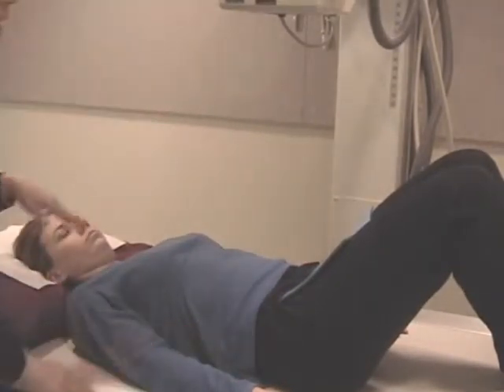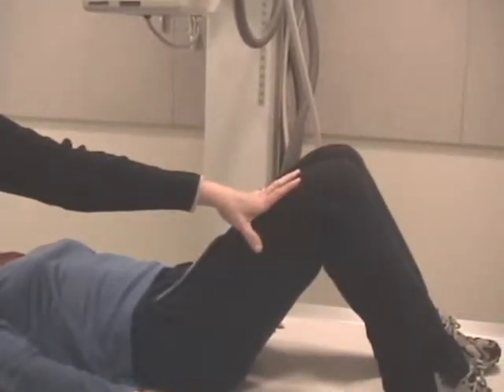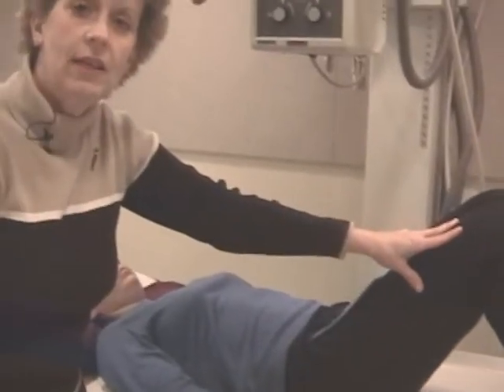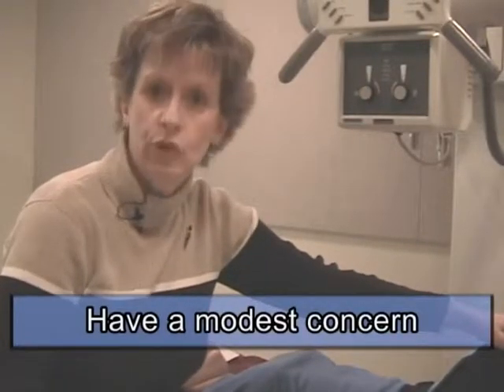Okay. I will caution you on the patient's knees. Some room orientations, the door might be over there, and the patient's knees are elevated. If that's the case, I would definitely cover the legs with a sheet. Hospital gowns might be long, or the patient might be in pajama bottoms. Modesty is a concern in this exam. So keep that in mind. Sheets, pajama bottoms, blankets, something, protect their modesty.